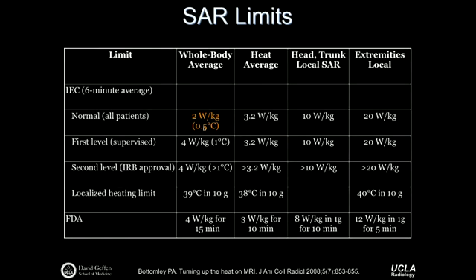Going above that requires operating the scanner in so-called first level mode. That means you can use MR sequences that may deposit as much as 4 watts per kilogram into the subject and can result in a body temperature increase of about 1 degree. And that's actually relatively common. If you look at a clinical protocol, there are probably several that require operating in first level mode. We cannot operate in second level mode unless it's a research application, and I don't know anyone here that's interested or seeking to do that. People back off pretty quickly when it comes to safety and so forth.